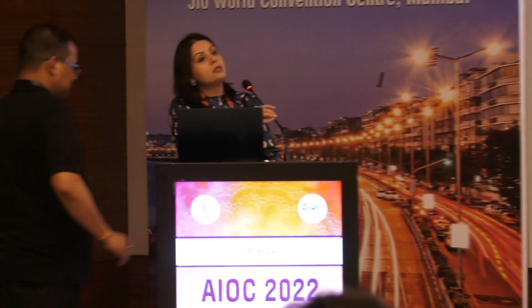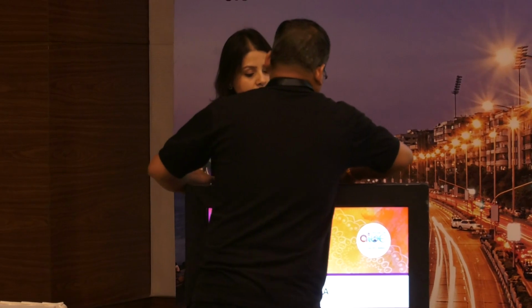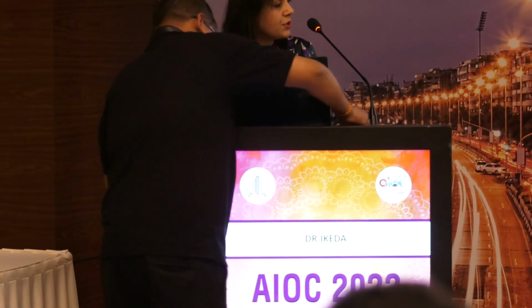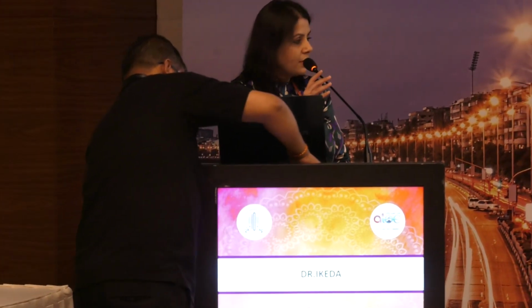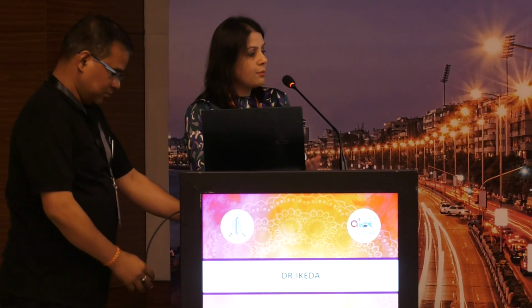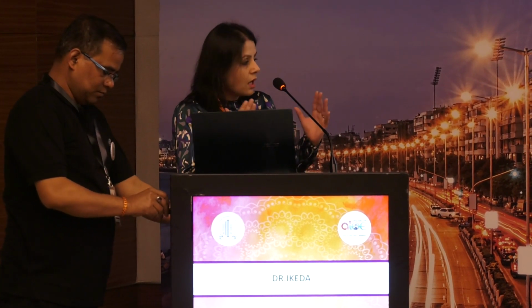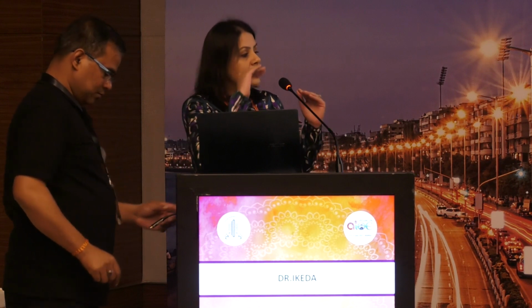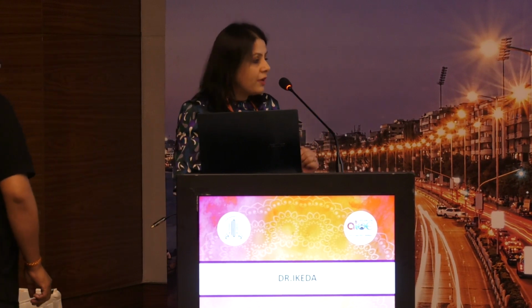So, if the lens was flipped, why do you think there was chronic raised intraocular pressure even after you explanted the lens? Yeah, so I think she said that the surgery had been done 5 months ago, but probably the iris got stretched because it was in that position. Although it should probably take longer, even in 5 months, because the ICL was upside down, it had been pushing the iris up. So it was basically like developing a secondary angle closure glaucoma, and the angles had become very, very narrow.